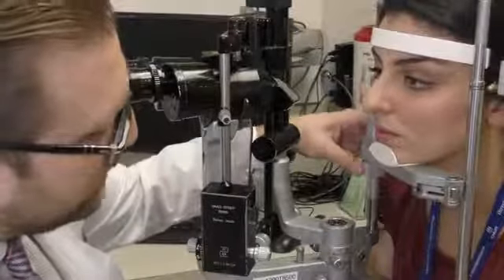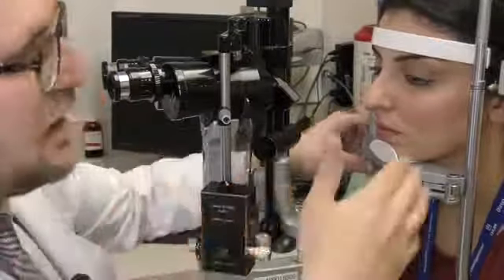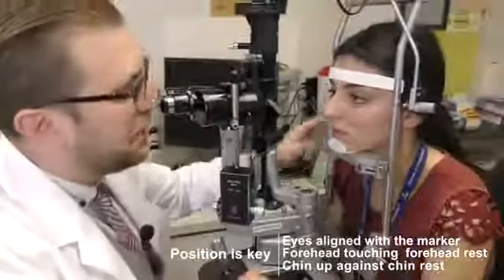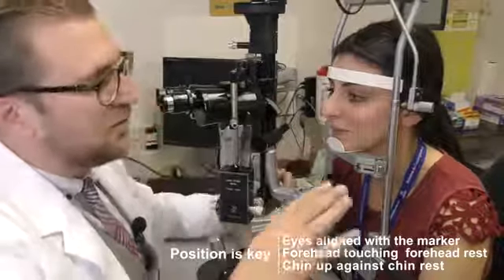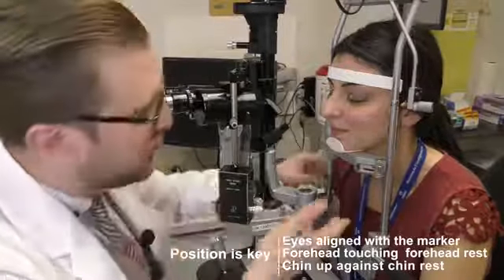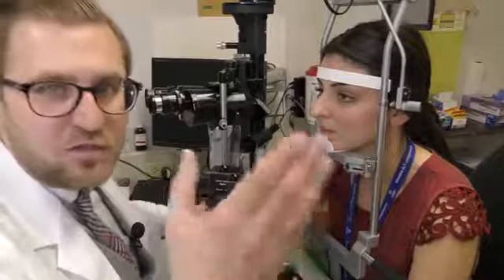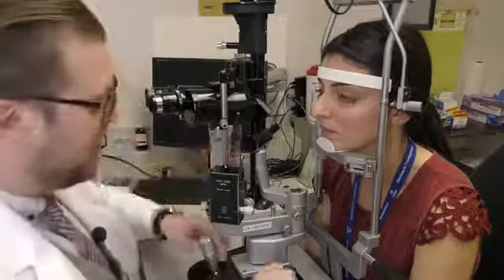So as I turn the knob counterclockwise, it goes down. As I turn it clockwise, it moves the whole machine up. And now I have her nicely lined up with the marker. Okay? Forehead is nicely touching, her chin is there. Are you comfortable? Is it a good height for you? Perfect. If you notice that the patient is then stretching their neck when you lift up the chin rest, you can also bring the table up and down as I showed you before. Okay, so looks like we're ready to get started now for the eye exam.